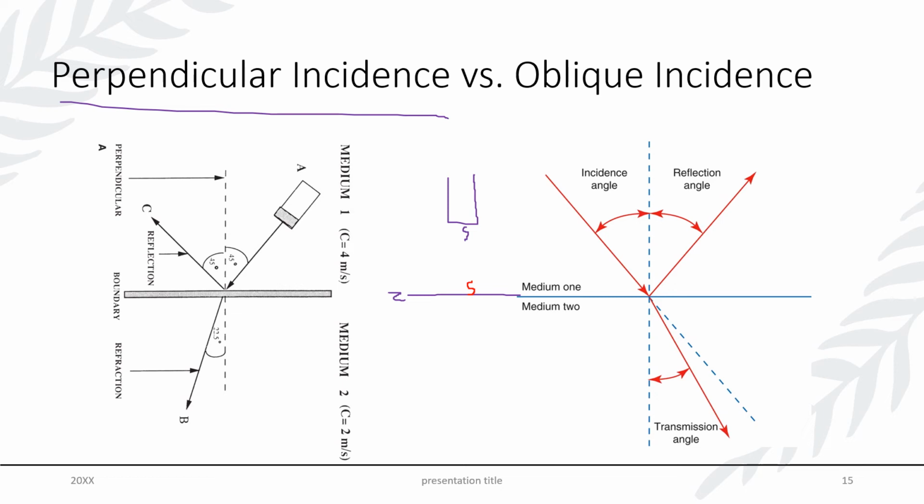So the majority of the time, we are actually going to be insonating tissue from an oblique incidence. Not a huge thing for you all to consider, but it does have an effect on certain artifacts that we may or may not see. So when we have an oblique incidence on a media, such as we have here, when we have a reflected sound wave, it's going to bounce off in a new direction like a ping pong ball. This is going to give us more of a scatter reaction than a true reflection.